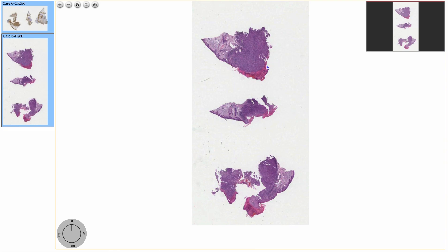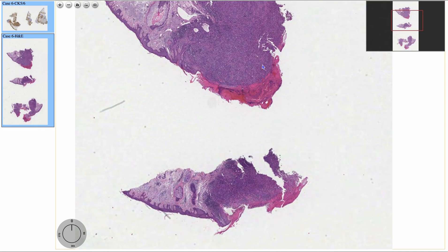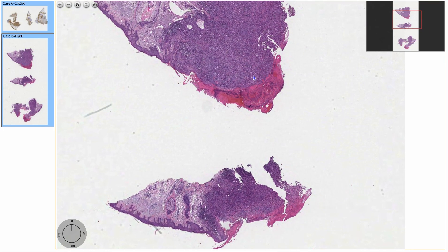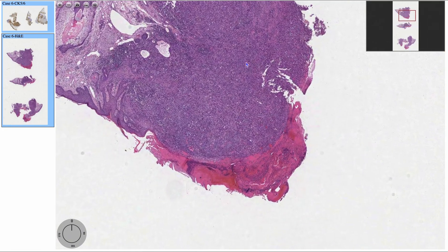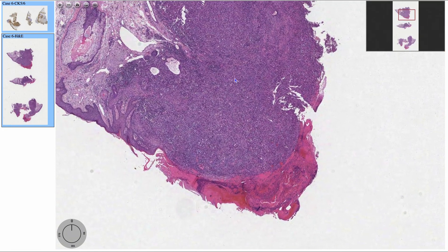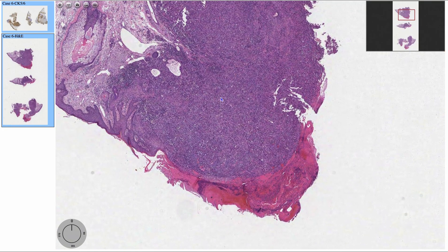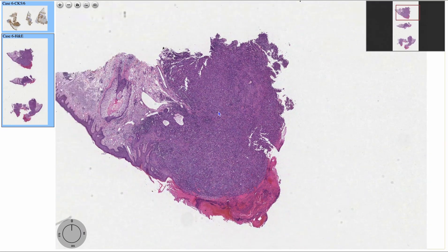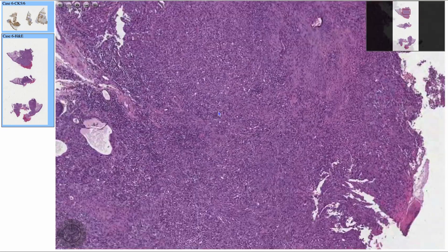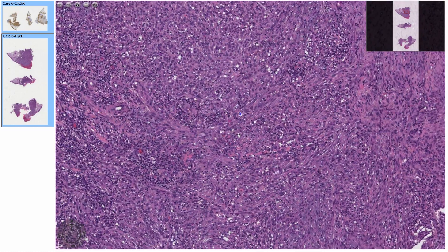Spindle cell squamous cell carcinoma. These are poorly differentiated. You generally don't see a squamous component. You don't see any keratinization. You don't see any intercellular bridges.